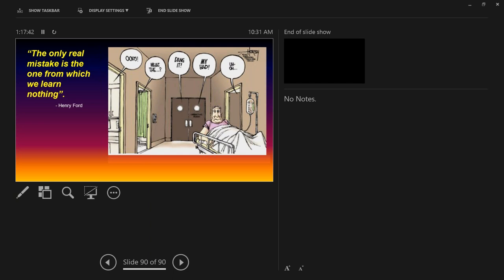What do you do with the manufacturer that is claiming plausible deniability? Let's say, for instance, to protect the innocent, there's a manufacturer, I won't mention any names, that has a device that keeps human organs alive prior to transplant. The manufacturer claimed that the device failed to sustain the organ because of poor hospital power. Okay, but yet the device had a history of its backup power supply failing. That UPS internal to the device had a tendency of failing. And we all know that inherently hospitals do not have good quality power.